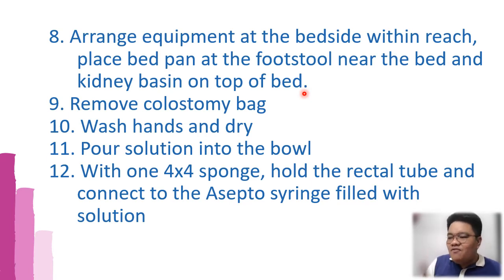One thing, future nurses, that you want to remember is that when you are working, all of the things that you should be needing should be within reach. Do not think that when you're doing a procedure, you always have an assistant. Most of the procedures that we are doing at the bedside, you don't need an assistant. That's why you are trained for that. So that's why, class, you can see arrange equipment at bedside within reach.